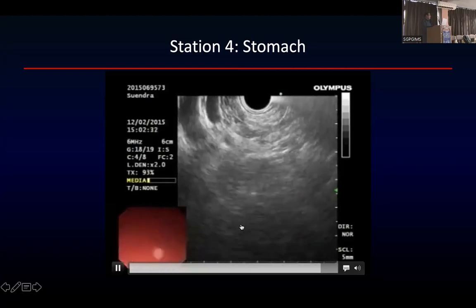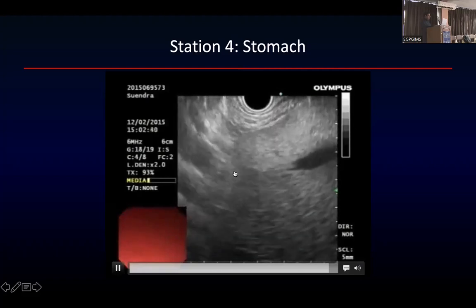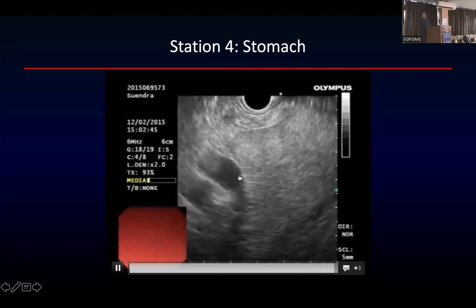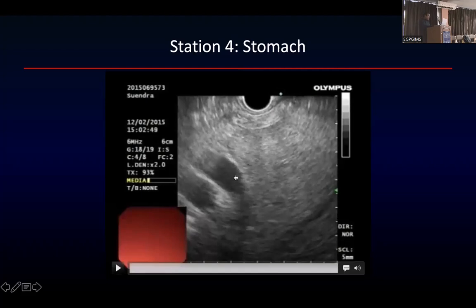What is the lower one? Head of the pancreas. Okay, so you are able to see the neck of the pancreas, you are able to see the head of the pancreas. This has entered the liver here. Can you see this now? Portal vein entering into the liver. That portal vein we have traced, so it's all a matter of tracing the structures. This is the portal vein in the liver.